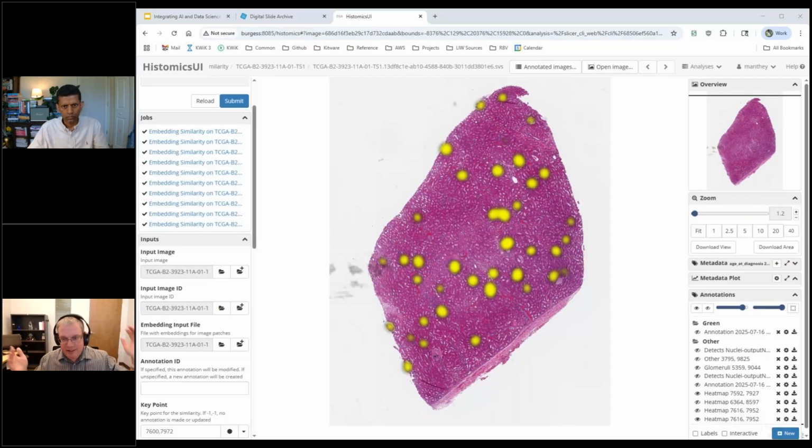Do I have patient age in any of this mess I got from file A versus file B? And that is still probably every format out there converting to DICOM, you'll get something. Well, you get everything you wanted, and that's a case by case basis of, can you do the job correctly? That's an intimidating thing to work on, just because there is so much variation in the wild. Literally.